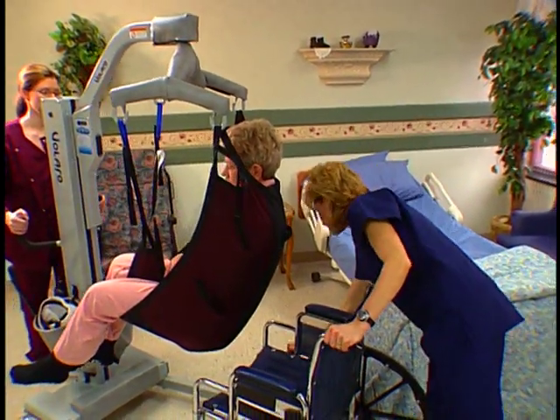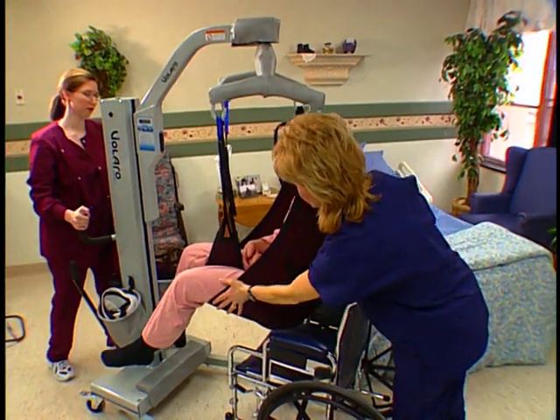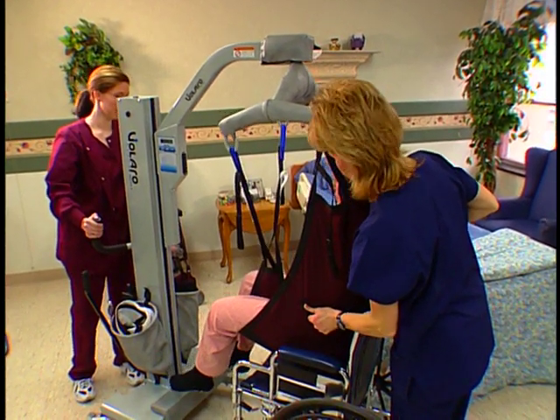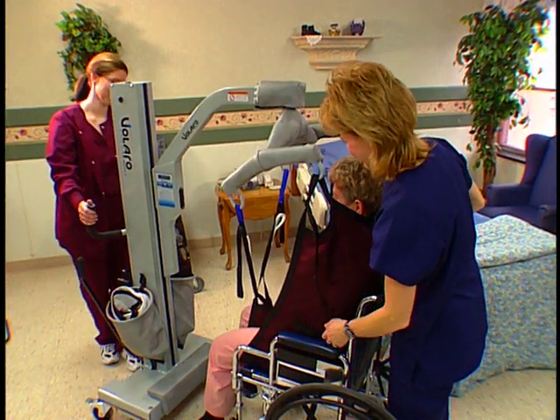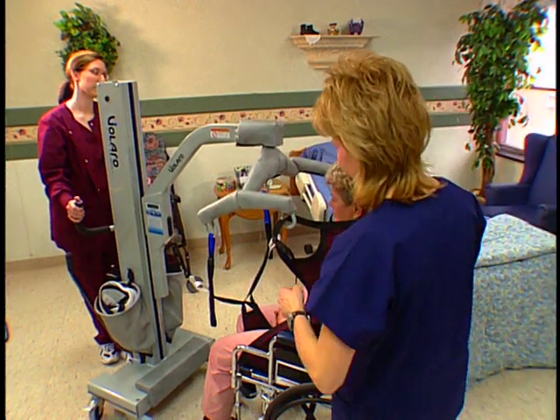Take the hand control and move behind the person. With both hands, grab the lateral handles attached to the back of the sling and begin lowering. Do not pull back on the handles until the person is about 1 inch above the seat of the chair. Then pull back. Use the best body mechanics possible. The person is now upright.